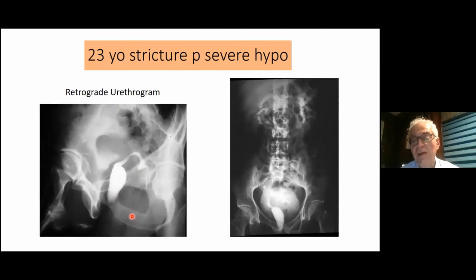disorder. So he had both ovarian tissue and testicular tissue, and he had this huge Mullerian remnant that wasn't usually a problem, but became a problem with the stricture. So when he voided with the stricture, a lot of urine would tend to accumulate here. He had infections and pain. But I thought it was a fascinating retrograde urethrogram.